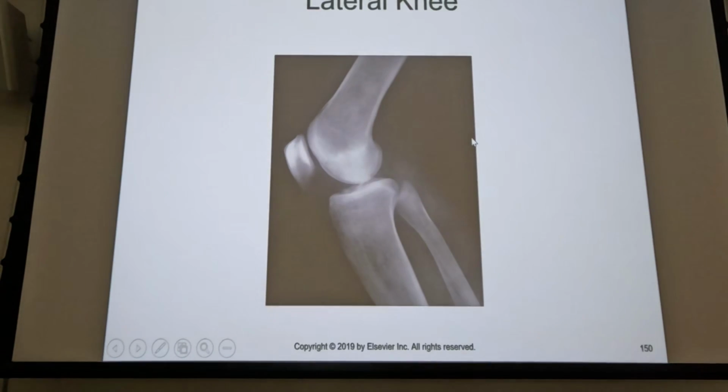Okay? Yeah, it looks like that. You see how they're not perfectly superimposed? You're never going to go back and reshoot that. Ever. Right? That's as good as you're going to get 95% of the time.